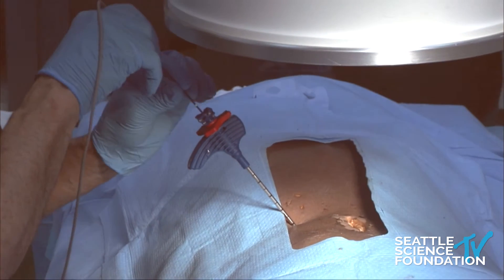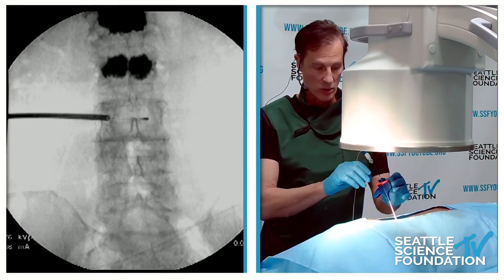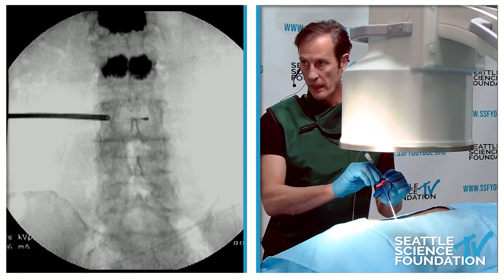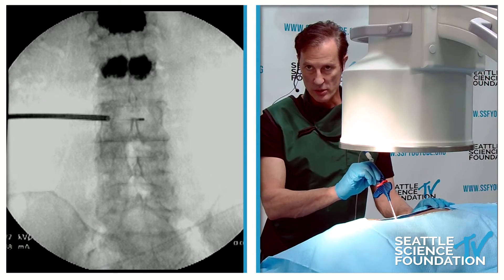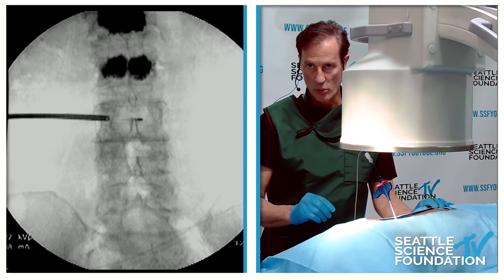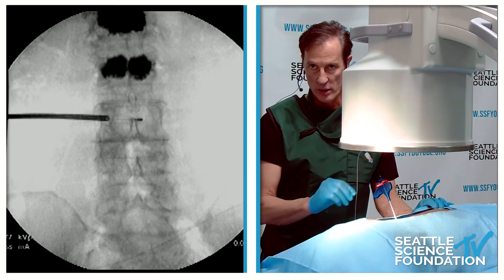I'm going to put this all the way down in and take a picture of that. I'm going to pull that back just a hair — you can see the distal tip, and the more proximal portion of the bipolar electrode is not quite as radiopaque.